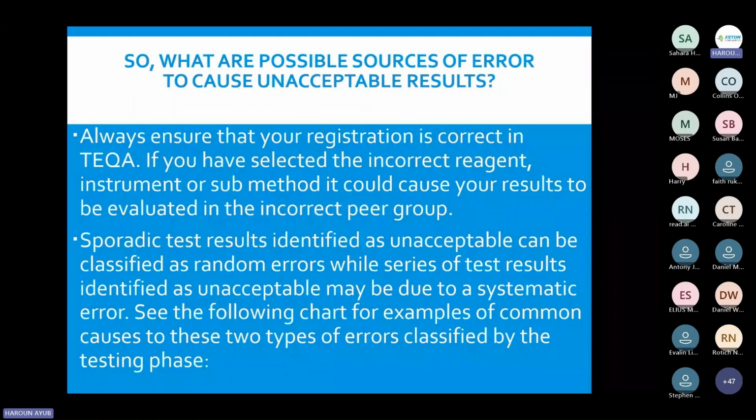Remember, when we started, we had to define systematic and random errors. You've been doing so well, and out of the blue, you get a failure. That can be classified as a random error. And then you have a systematic error, as we have seen in the trend graph, where all results have been consistently on the upper side of the LJ or the Shewhart chart.